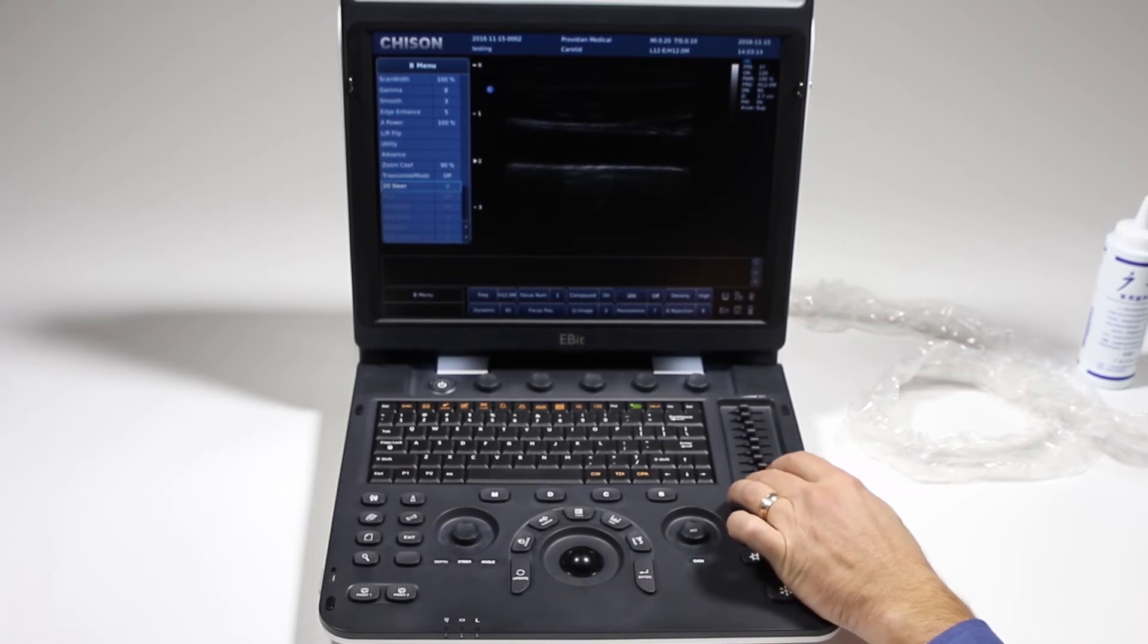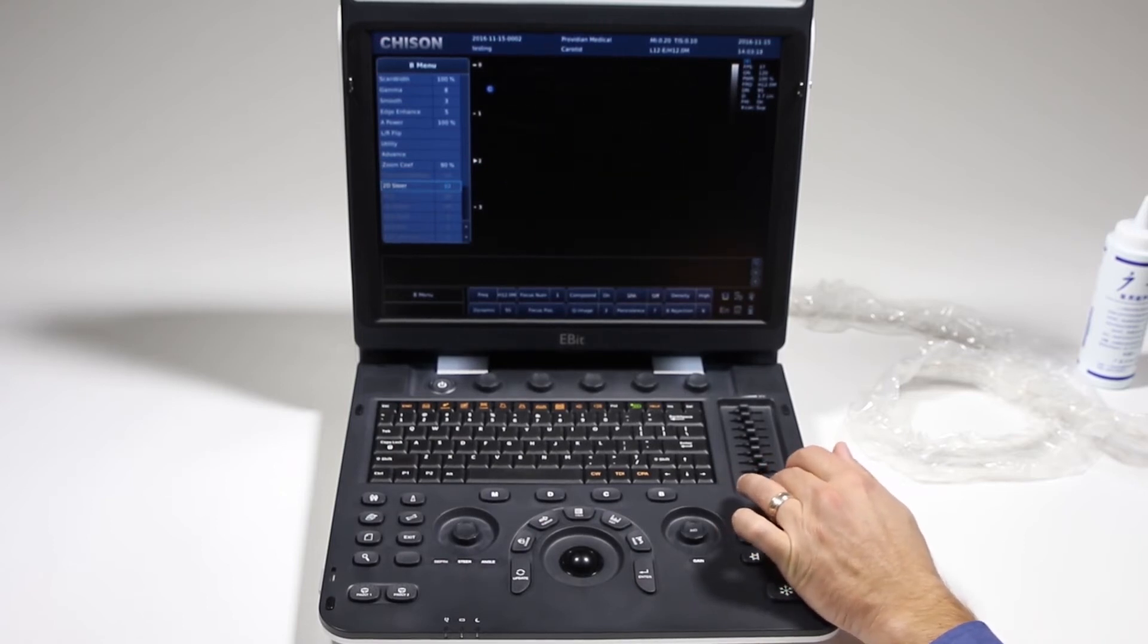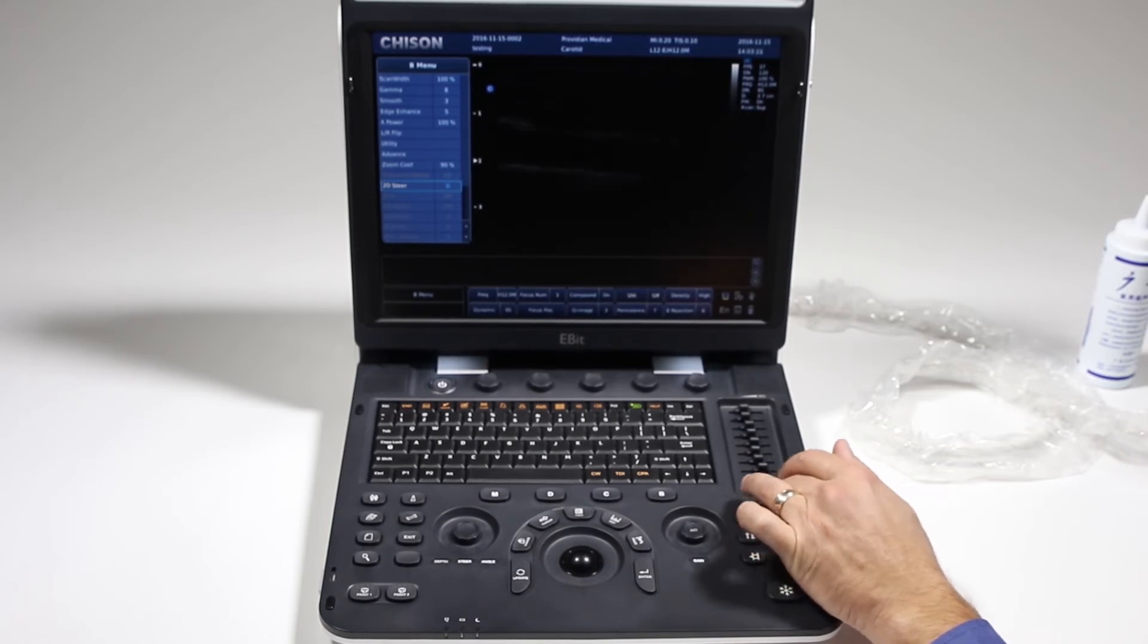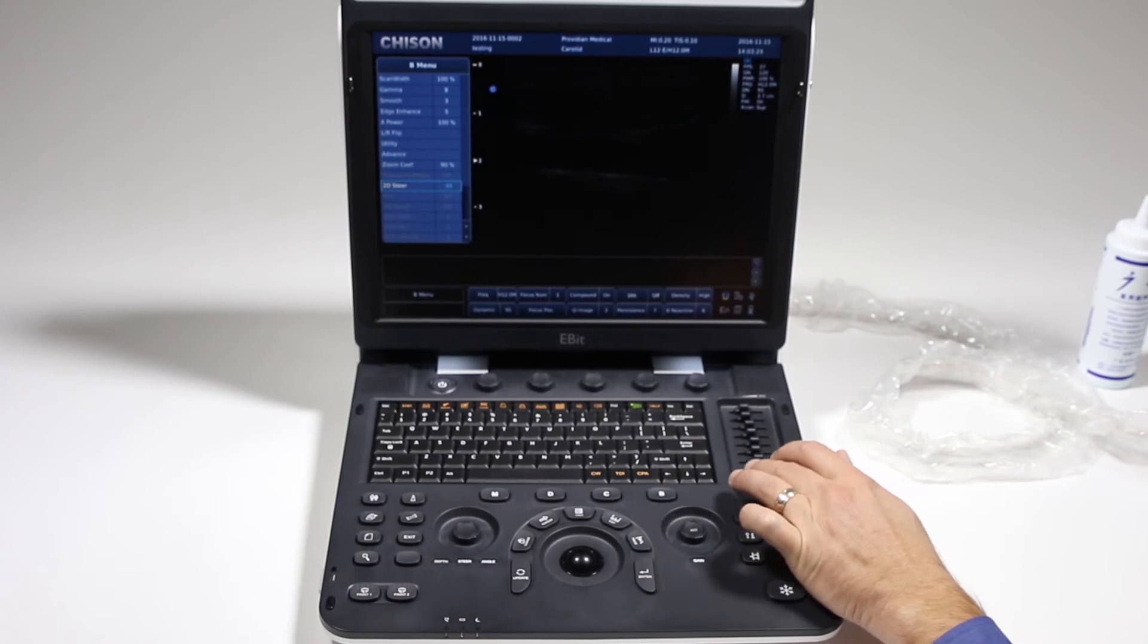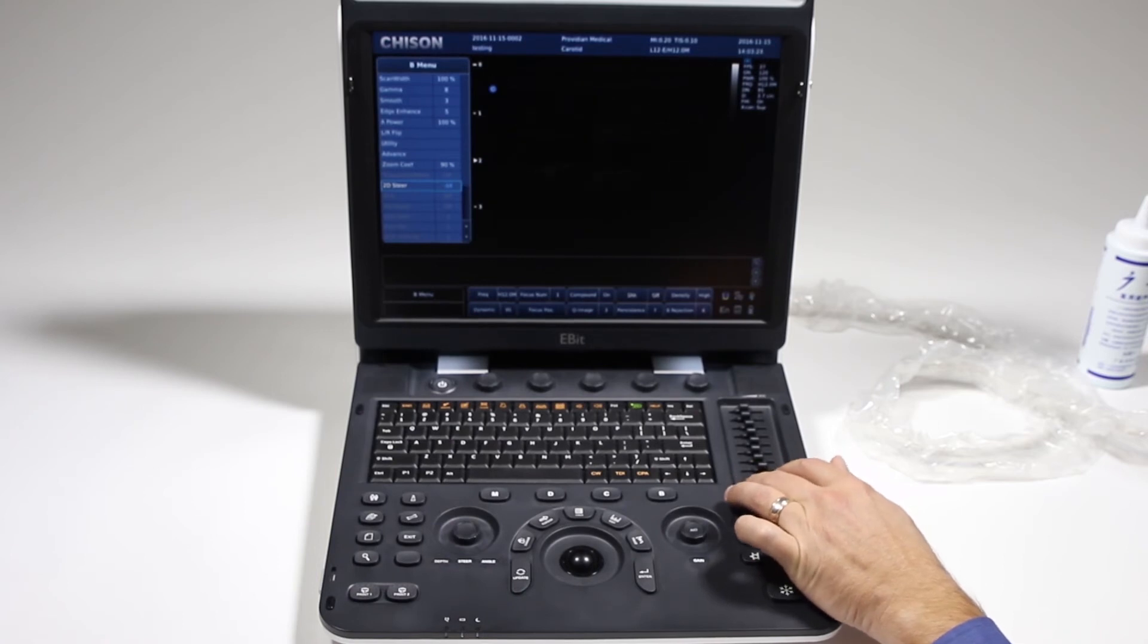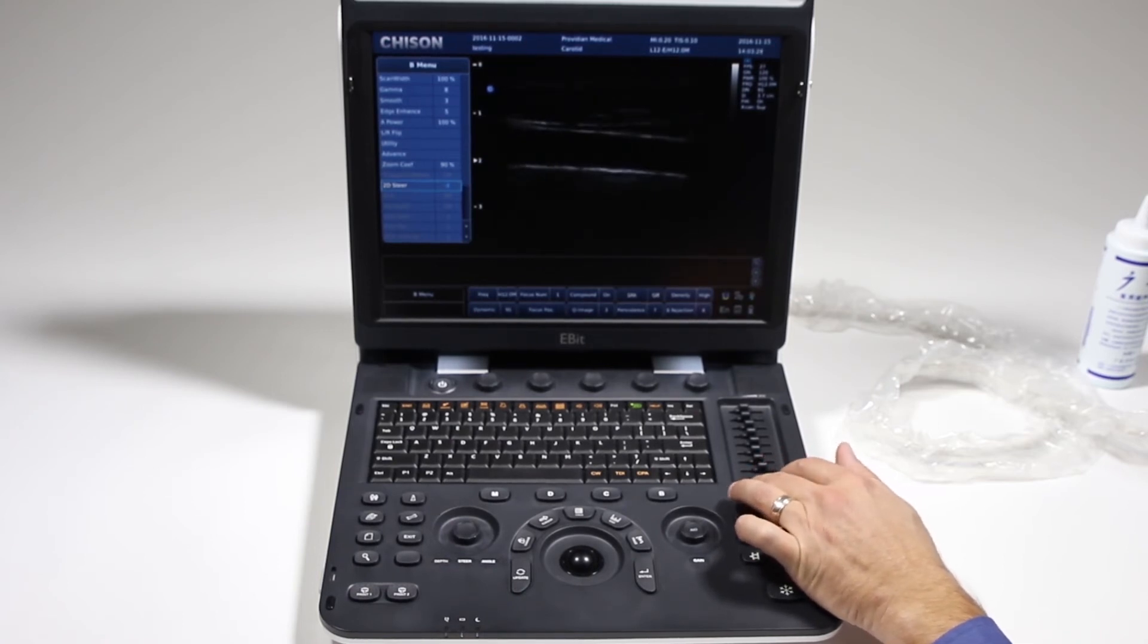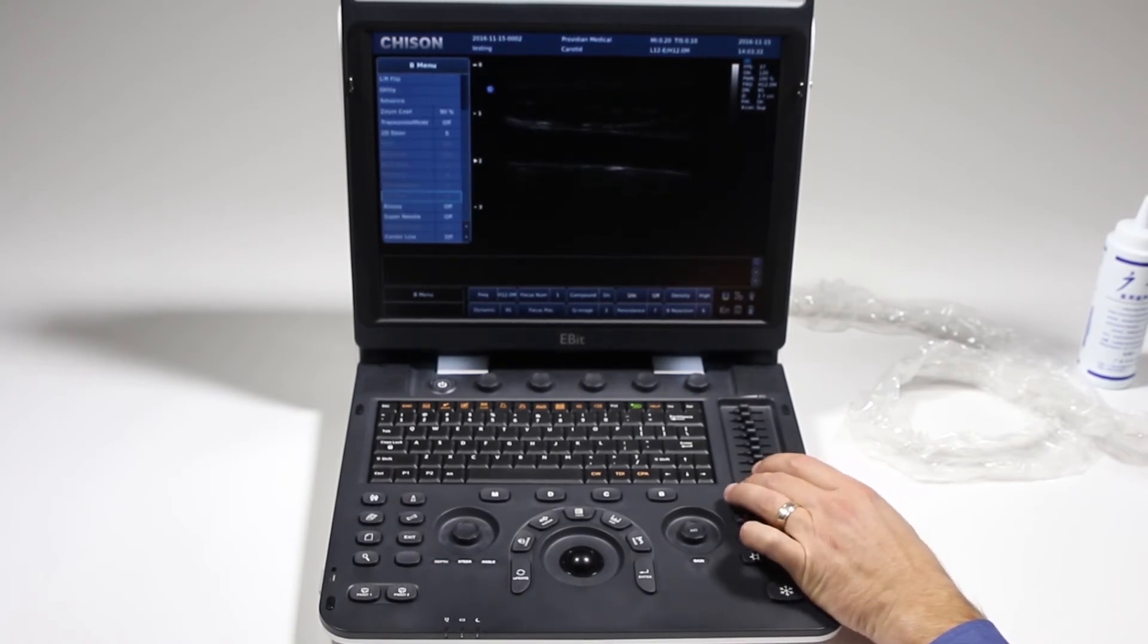2D steer, I showed this in the first video, but this will actually show you what it does. It has a fairly dramatic effect on the image, so if you're trying to get a certain type of image, you can use that to give, if you're looking for a certain type of tissue or trying to see around something, that's a good way to go about using that technology.